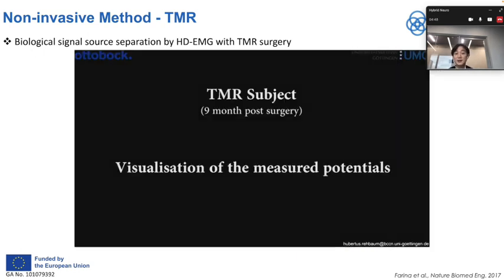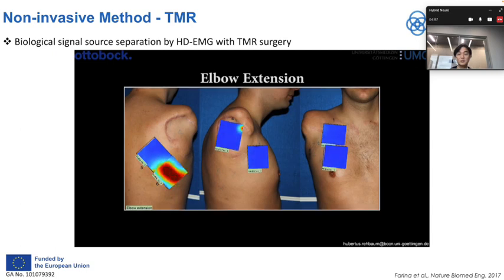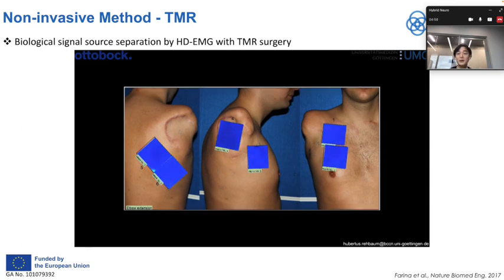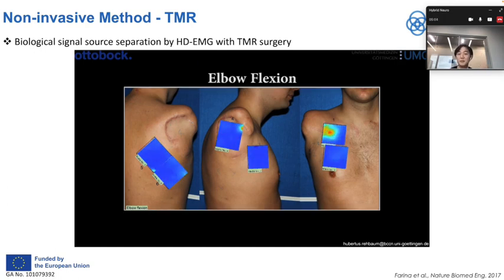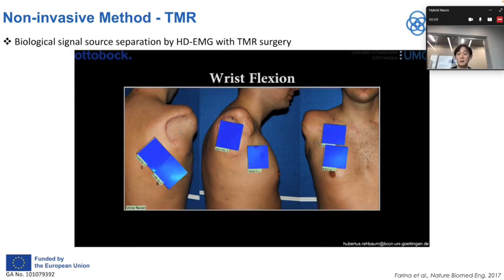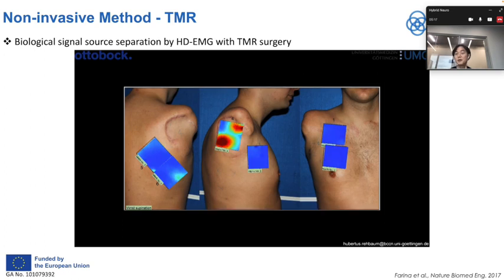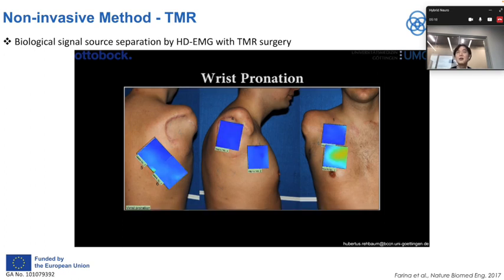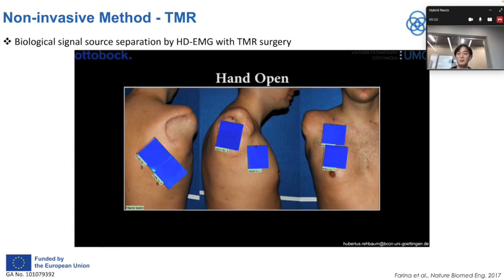This is an example video showing how a patient who had TMR surgery can produce separated motor intent activations. The command shown at the top of the slide is the motor command from the patient, and the blue displays show what we are getting from EMG activity. As you can see, different motor commands produce different heat maps from the muscles, which represents much higher control dimensions than the conventional method.